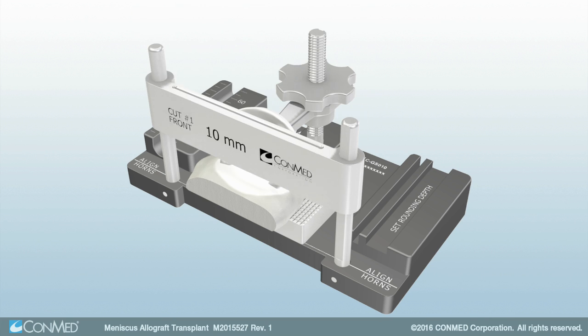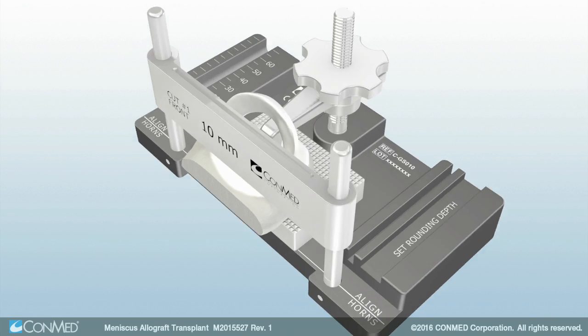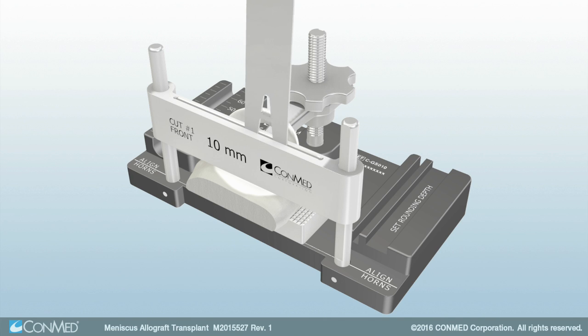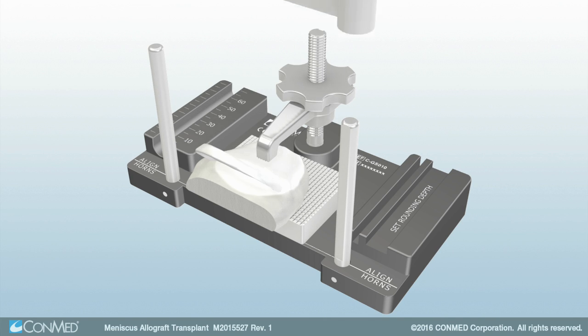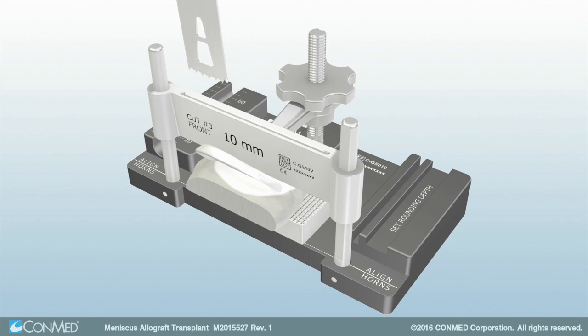Next, place the vertical fence over the guideposts so that the etching that reads Cut No. 1 faces the front of the graft station. Insert the saw blade to confirm the meniscus horns will not be damaged. Repeat this step with the Cut No. 3 etching facing the front of the graft station.